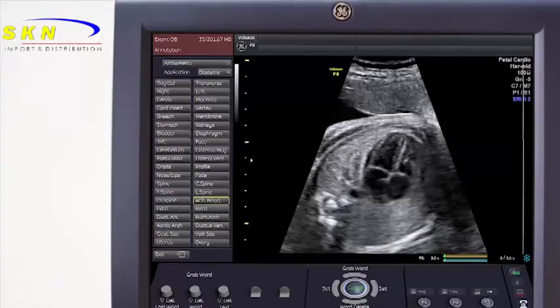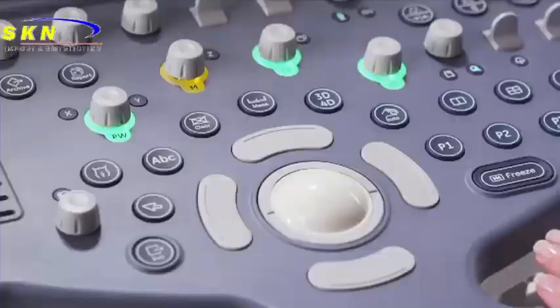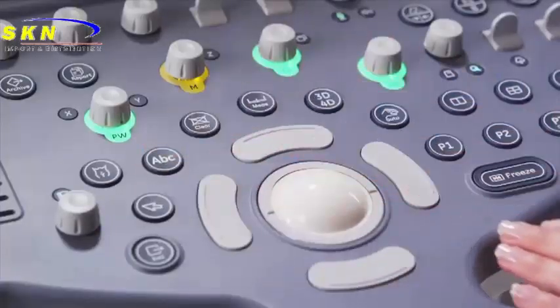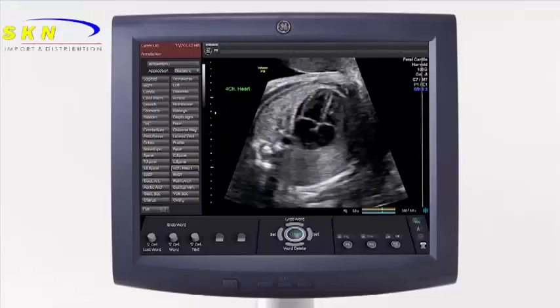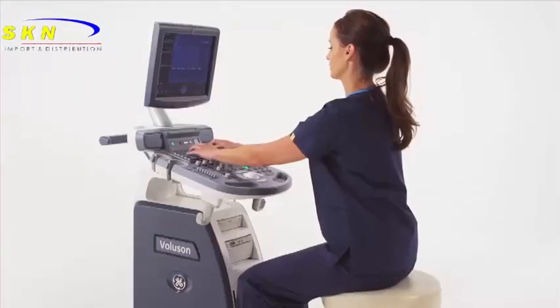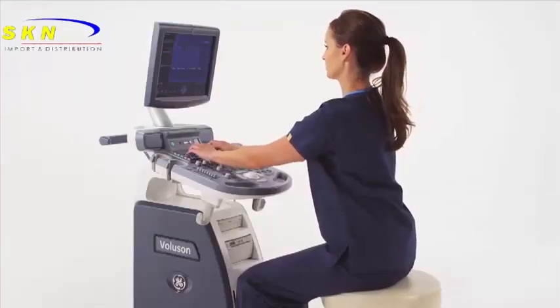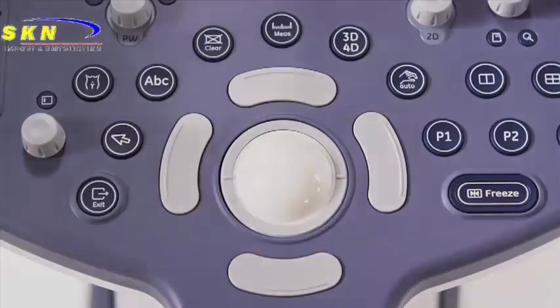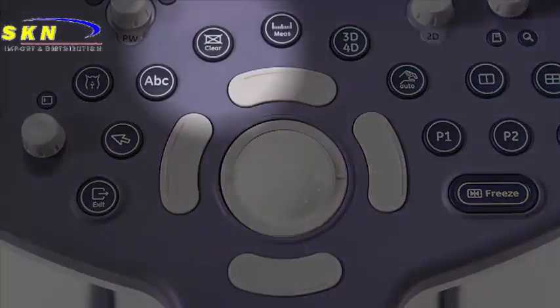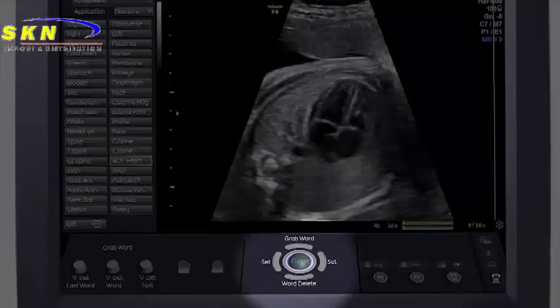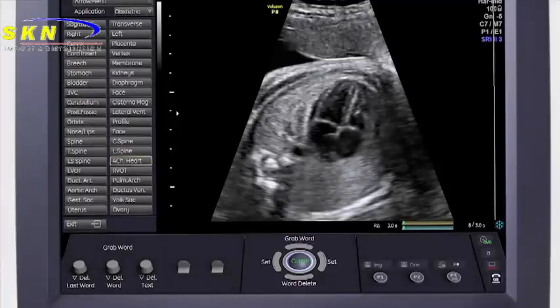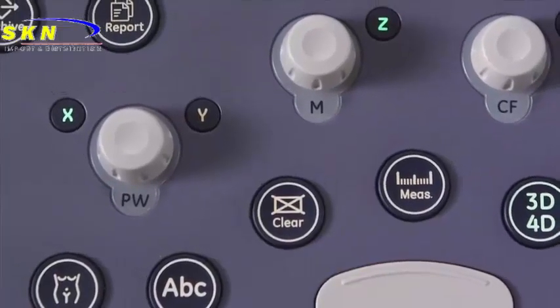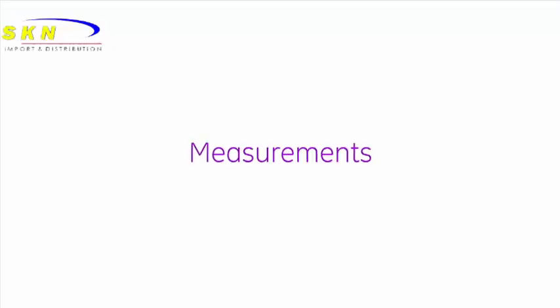There is a customizable annotations library that can be viewed on the display menu by selecting the ABC hard key. Words can be chosen and placed using the trackball and set keys. Freehand typing is always an option to allow for user preference. Annotations can be removed by selecting the clear hard key or the word delete trackball key — that will erase the last word placed. The clear key also clears active measurements and body markers.